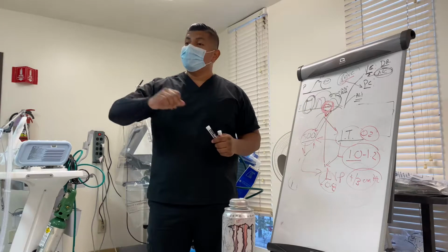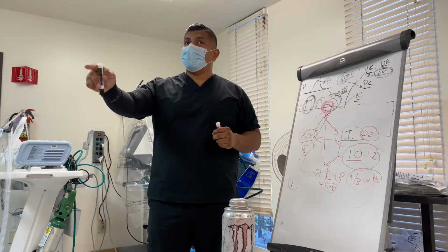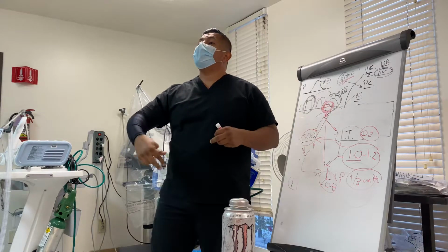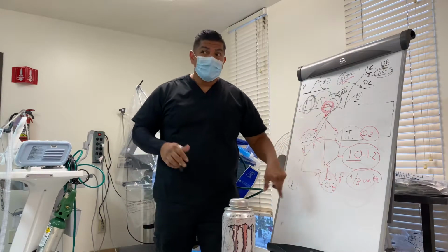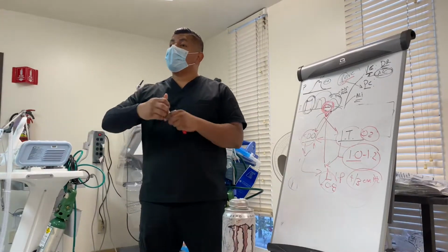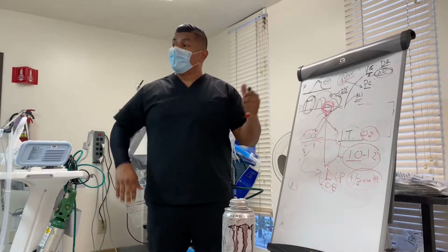Why is that? Your septicemia patients, these kinds of patients that we're receiving here, are better served on PRVC, depending on what the respiratory demand is at the moment. If the respiratory demand is super high, the minute ventilations are greater than 10 or 15, where your I times have to be adjusted, maybe not the best thing. But if they're stable enough where you're managing their minute ventilation adequately, PRVC will deliver the least amount of pressure possible to get that tidal volume.